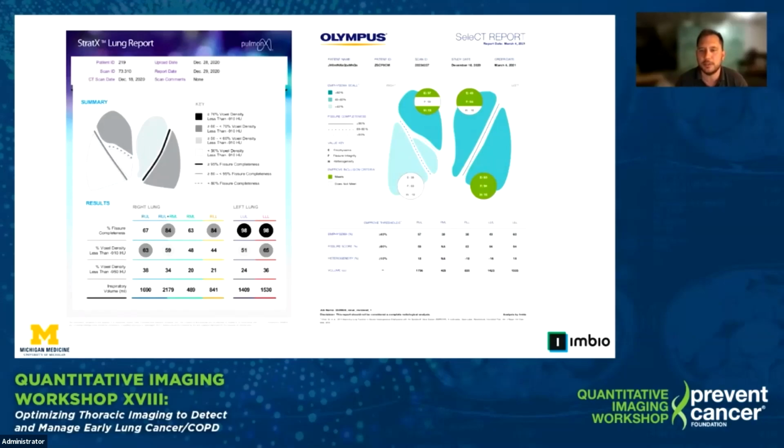Many clinicians simply aren't aware that correct reconstruction parameters are important for quantitative imaging, but are receptive to changing protocols and being provided educational materials. Other sites cannot change their imaging protocols for bureaucratic reasons. Technical guidance documents are critical to remedying these issues.